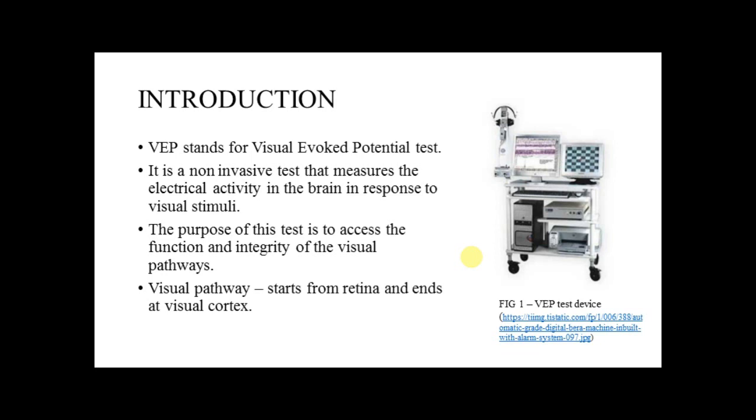Firstly, it is a non-invasive test, and it measures the electrical activity in the brain in response to visual stimuli. Visual stimuli means any picture or any patterns that we can see. And here is the image of the VEP test device. As you can see, there are some monitors, some CPU, some system there.